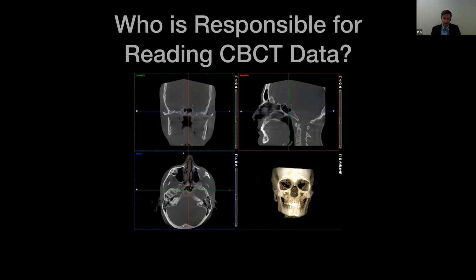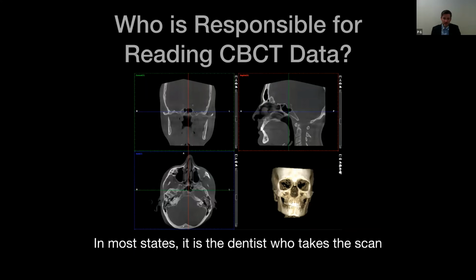and really in most states, it is the dentist who takes the scan that is responsible for getting the cone beam scan read. But again, I want to emphasize that it's just recognition of abnormal and document what you see in a written report.